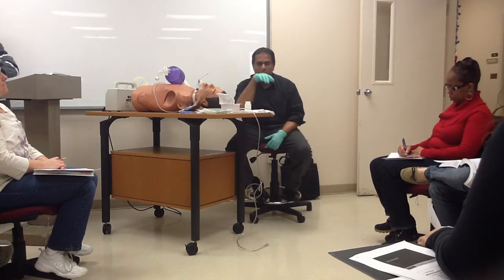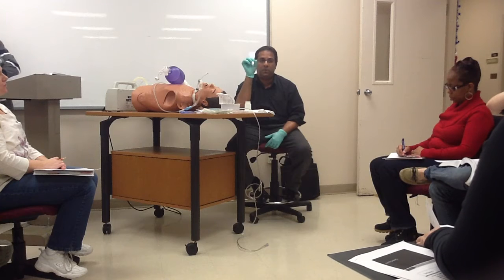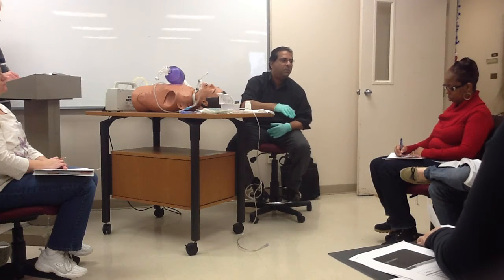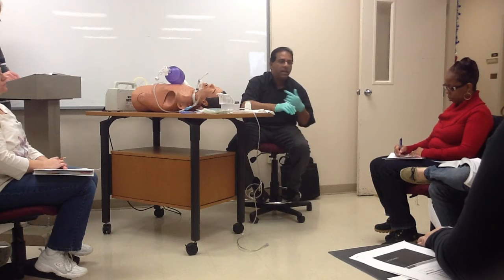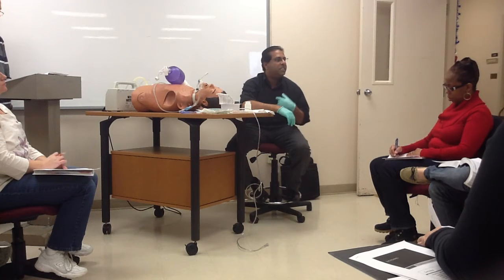So this is the main difference with suctioning the trach. This is extremely important. You have to pay attention to it because when you come to the hospital, you know how many thousand times I go into a patient room, they have a number 4 trach in, and they have a 14 French suction catheter sitting there, and nurses are suctioning them with the 14 French suction catheter. And the patient is bleeding.